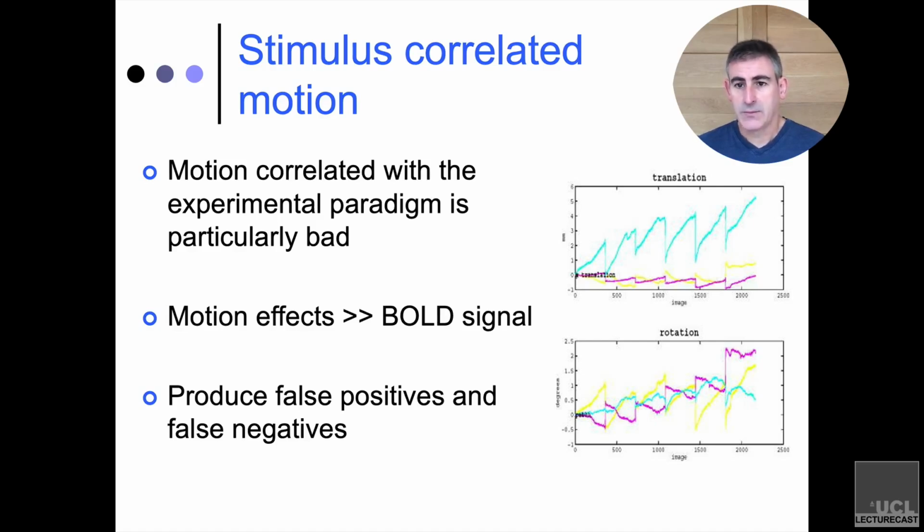So if you have a block design and you see that you get motion effects like this, so that is to say a block of task comes on and people sort of focus and they pay attention, and meanwhile their head's going back, and then it's rest and then they focus. So they're doing this in a kind of consistent way that fits the paradigm. There's nothing recoverable in those data.